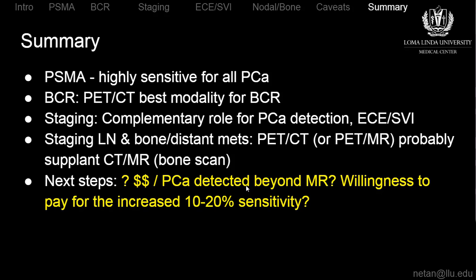Currently, PSMA is not FDA approved. This is on a per institution basis because gallium-68 PSMA is open IP. However, as studies unfold, hopefully we will have wider availability of PSMA for patients.